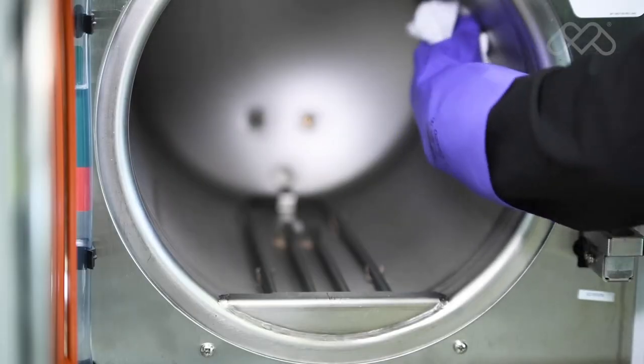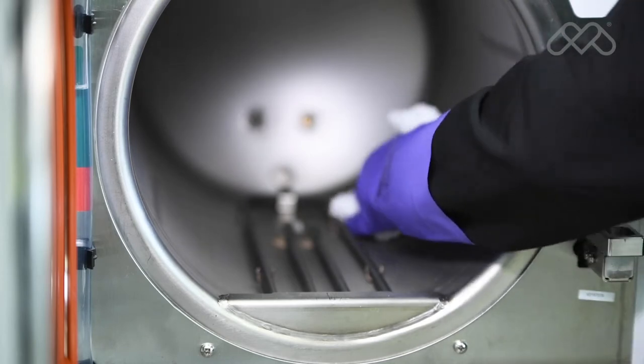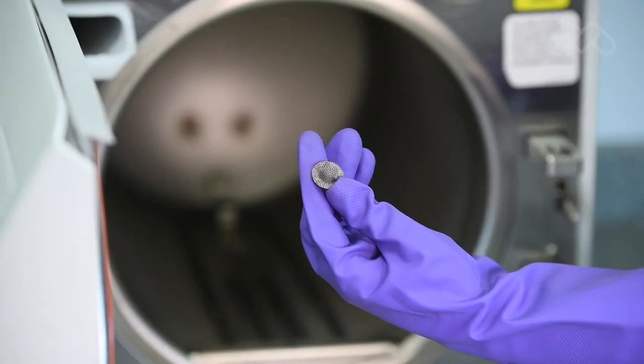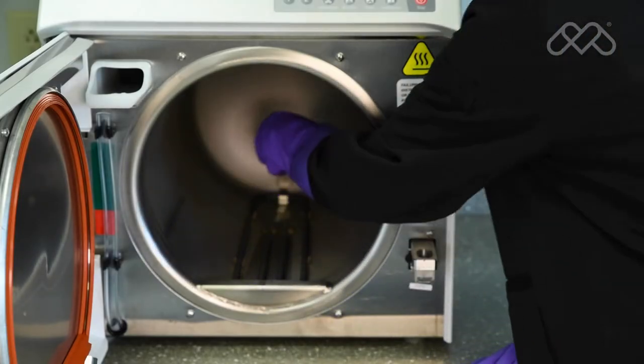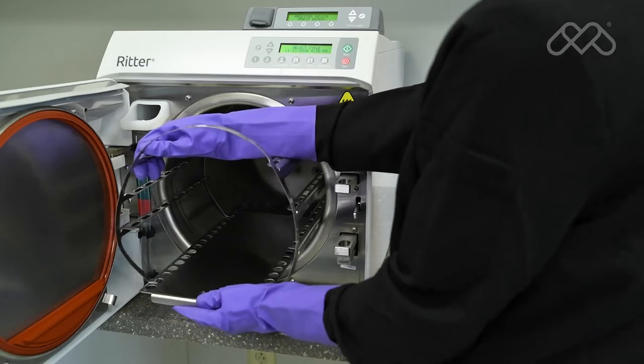Wipe the inside of the sterilizer chamber, being careful not to damage the heating element, steam temperature probe, or water level sensor. Reinsert the filters into the appropriate holes by pushing downward while twisting slightly, then reinstall the tray rack.